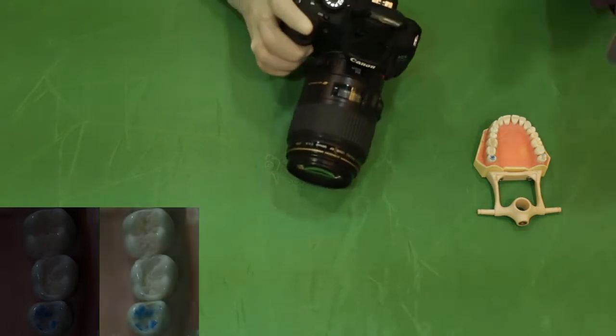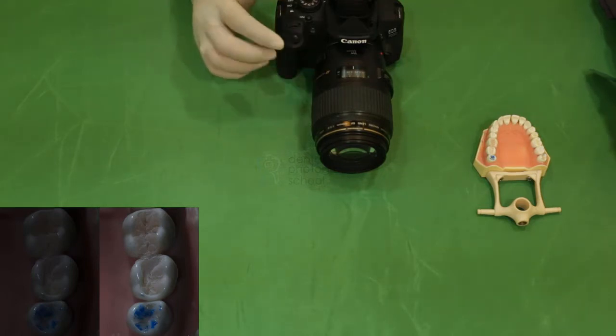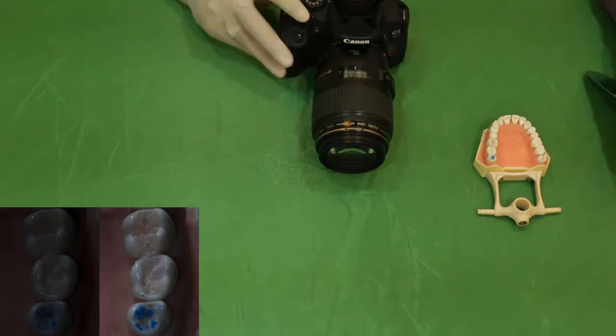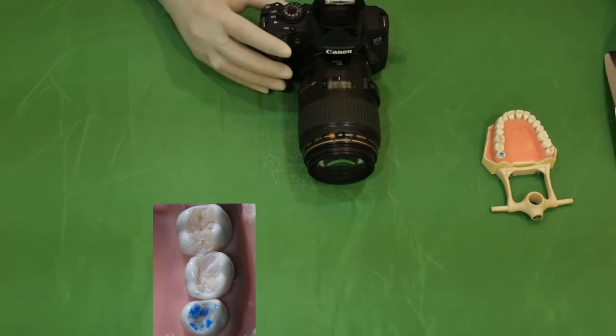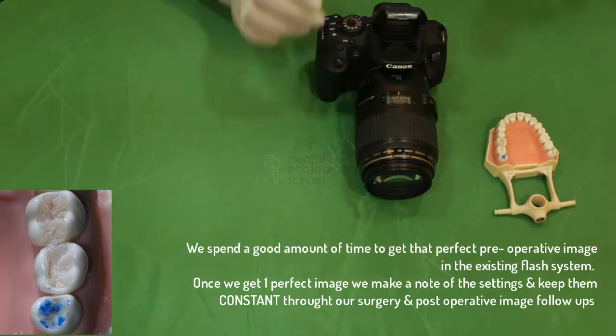If you want to focus, move forward and back. When you achieve focus, make the image. This is the second image we got using our exposure triangle knowledge. We feel we need one more shot to get the best image. Let's try once again to achieve the best image for our surgical field. This is the final image, and we think it's perfect for our surgical procedure at this point.